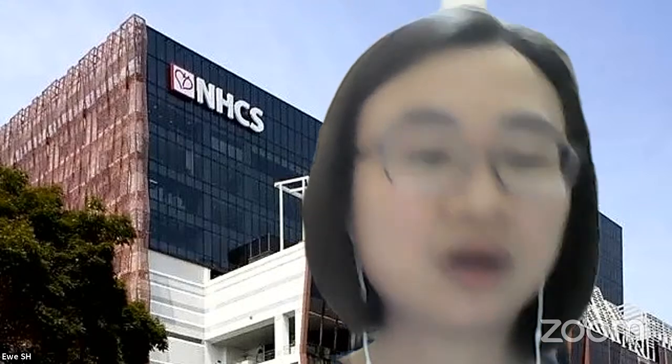Thank you very much, Professor Yi, for these questions. I think it's always an important clinical decision-making issue: whom should we trust? A few years ago I looked at which aortic regurgitations correlate well with CMR and which do not. If you have central aortic regurgitation, the PISA quantification on echo seems to correlate quite well with CMR, which means you can trust your echo measurements, whether by quantitative methods such as PISA on echo, or on 3D echo.